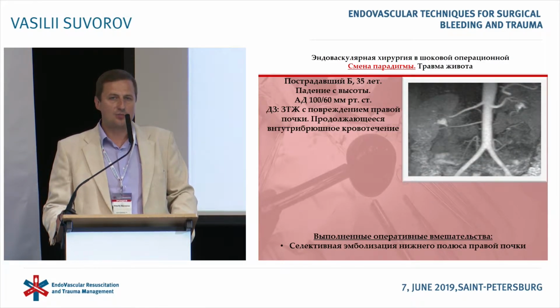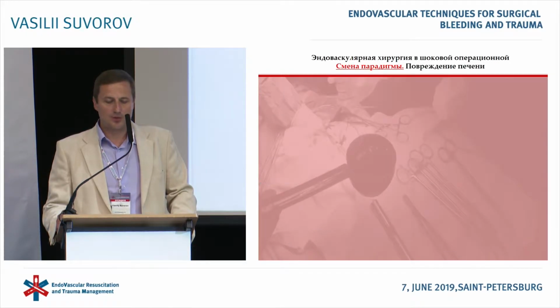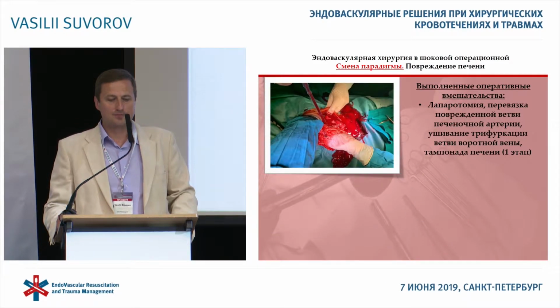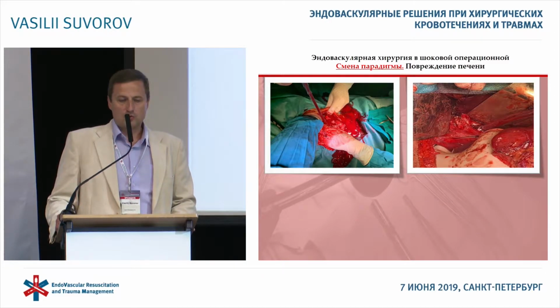The problem in the abdomen as of today with parenchymatous organs damage may be resolved only endovascular, be it kidney with pseudoaneurysm. We carry out embolization of this pseudoaneurysm. As for spleens, damaged spleens, no problems at all. And the percentage of splenectomies in our clinic is minimal as of today.